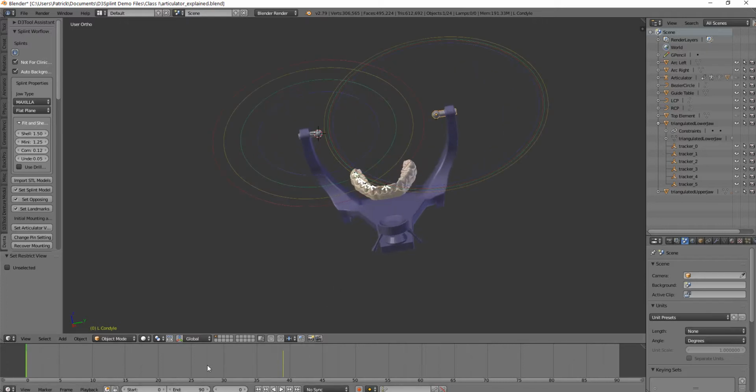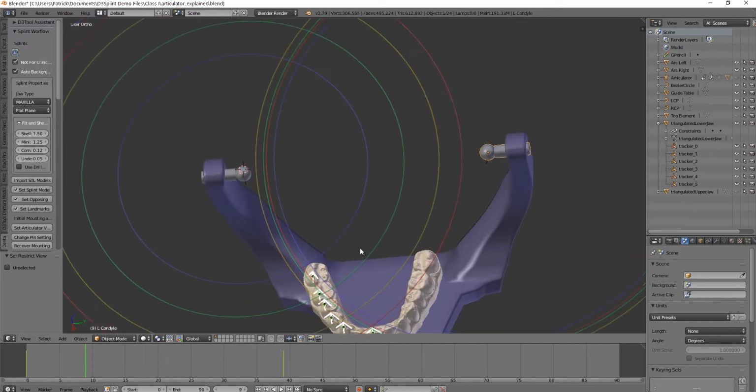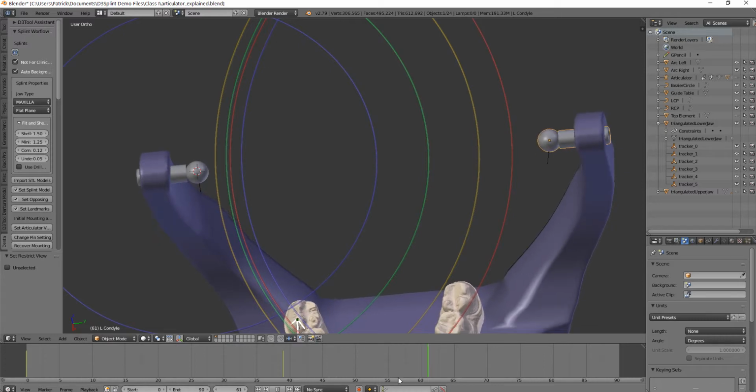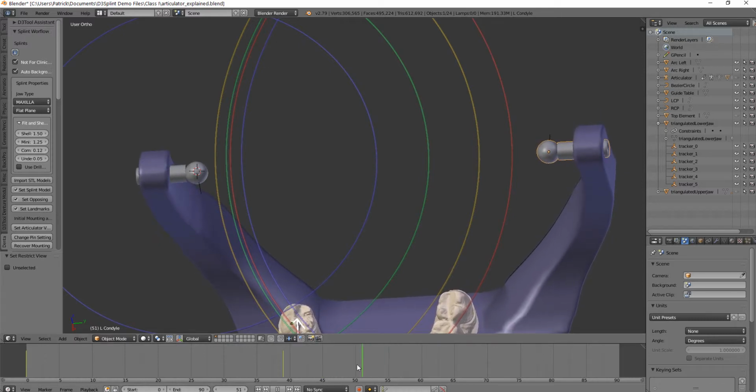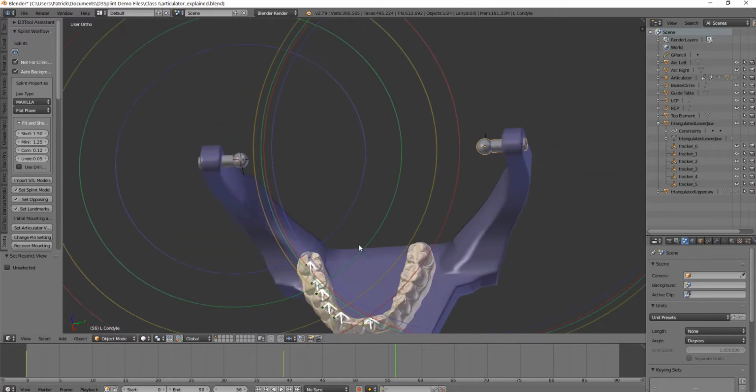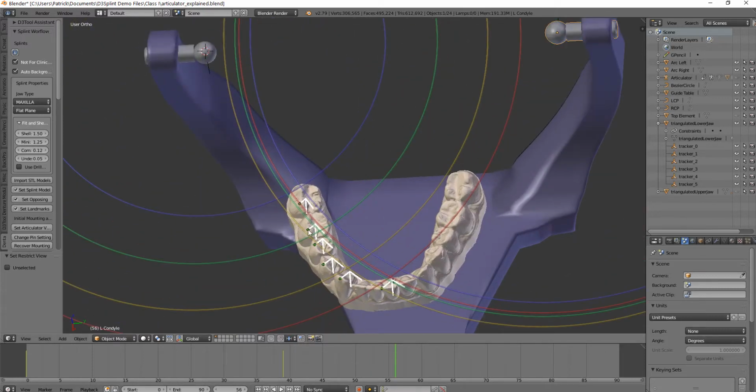But if you look at the non-rotating condyle, the one that's supposed to be sitting still, a tiny bit of movement is being created here by the simulation. And that is, I believe, the source of that little bit of error that you're seeing in the extremes of the simulation.